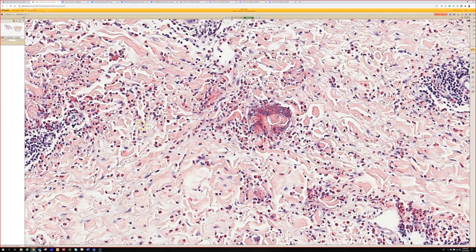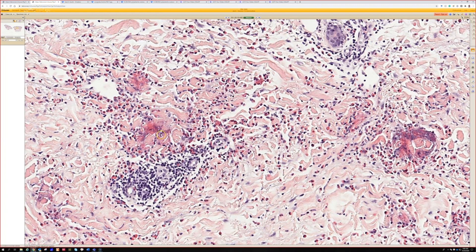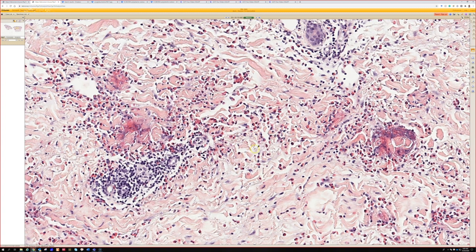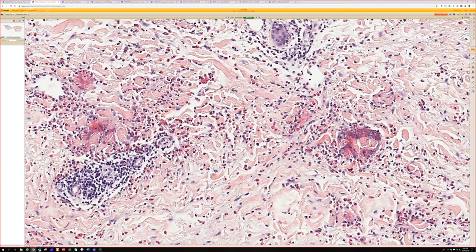And there are these ring-like deposits along the collagen bundles, which are the flame figures. While not 100% specific for Wells, Wells syndrome is the first thing that comes to mind — but if there was vasculitis in the head or depending on the clinical, like eosinophilic annular erythema, which we've seen recently — it depends on the clinical.